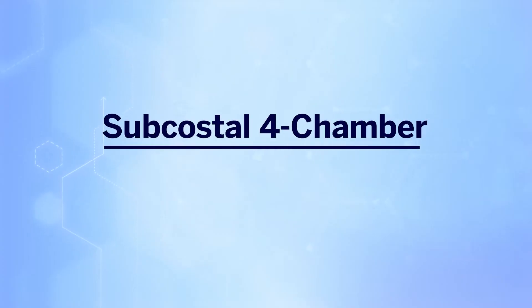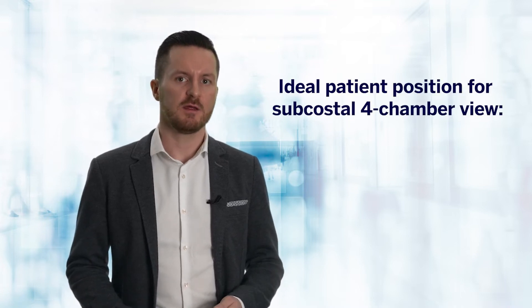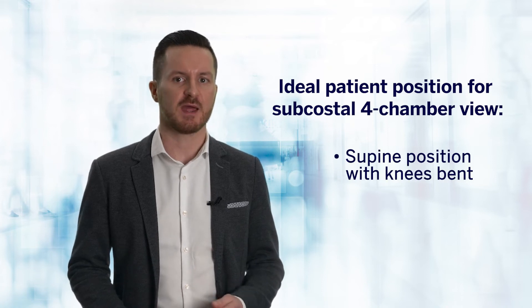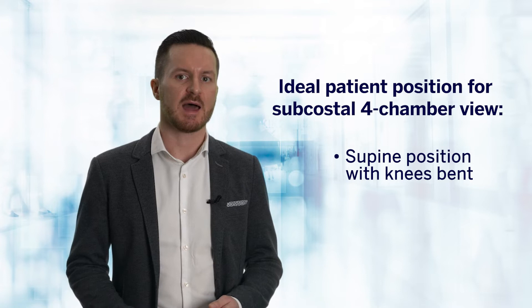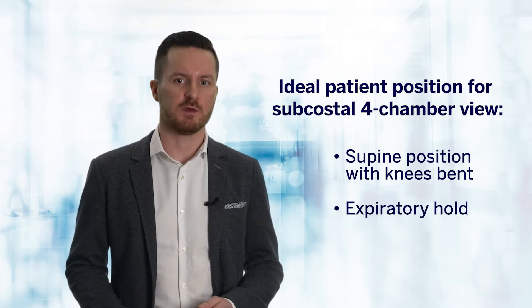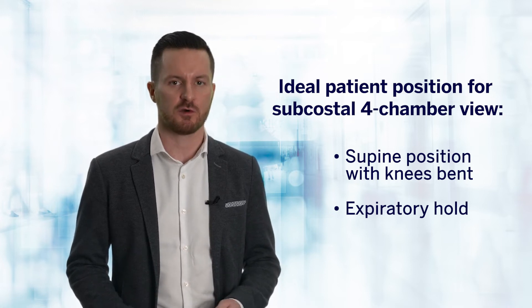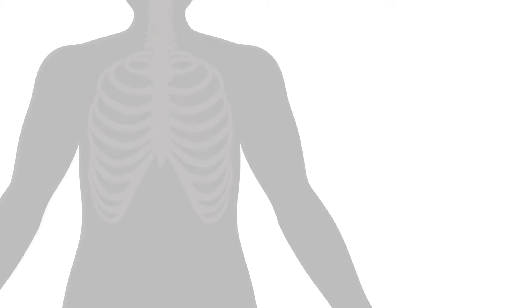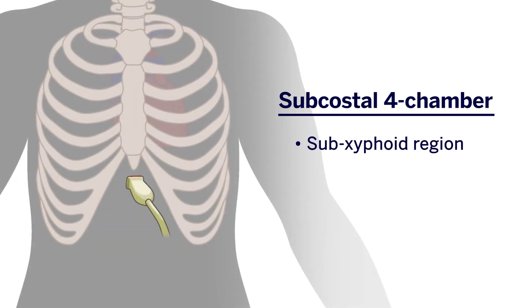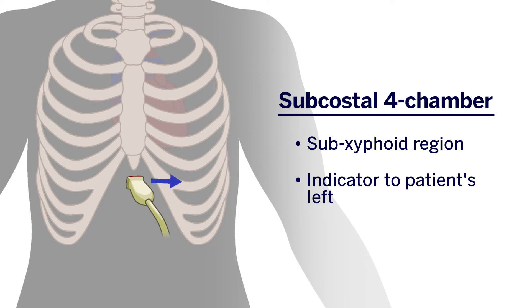Our next view is the subcostal four-chamber view. Obtaining this view can be uncomfortable for patients, and patient positioning is important for optimizing windows and image quality. Ideally, the patient should be in the supine position with the knees bent to relax the abdominal musculature, and if possible, an inspiratory hold can be useful for image optimization, as it serves to bring cardiac structures closer to the probe. The ultrasound probe is placed in the sub-xiphoid region with the probe indicator facing towards the patient's left side at approximately the three o'clock position, as indicated by the blue arrow in this diagram.